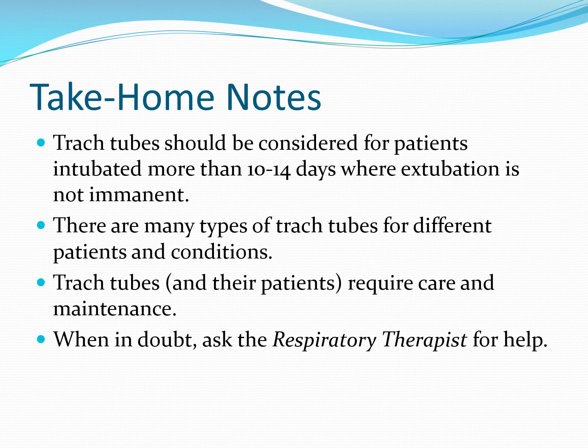So, a lot of the folks that are probably listening to this are respiratory therapists. But if you're a new grad or you just haven't worked around tracheostomy tubes and trachs very much, no problem in asking for help. If you're a nurse, and my wife's a nurse, and you want to learn more about this, good idea to get a respiratory therapist or a pulmonologist involved, so you can make sure that you're completely up to snuff.